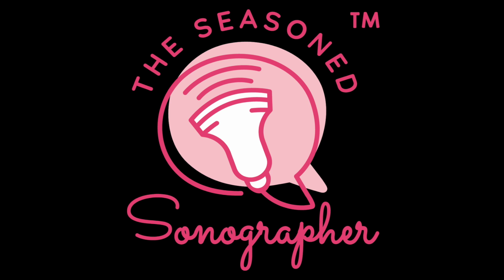You can make sure that first trimester transvaginal ultrasound EDD matches with the last menstrual period that the patient gives you within 5 to 7 days, depending on the gestational age when you look at the chart. If it doesn't match, then you will go by the transvaginal ultrasound due date.